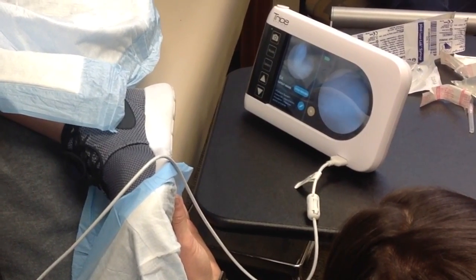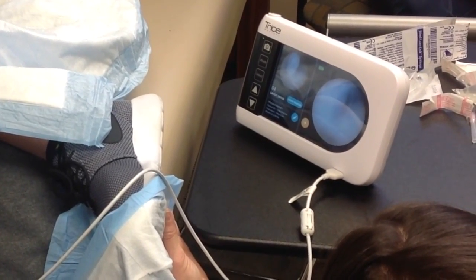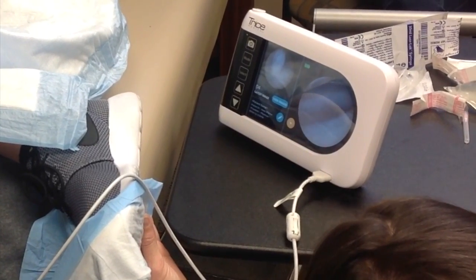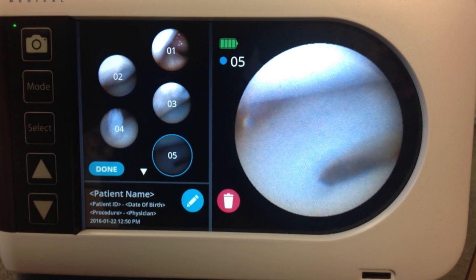If your insurance allows, this gives us real-time evaluation of your knee and a same-day diagnosis, as opposed to having to wait for an MRI. This allows us to better plan and take care of our patients. We can perform this on multiple joints in the body, and most insurances approve it. So there's a nice picture of a well-healed meniscus.